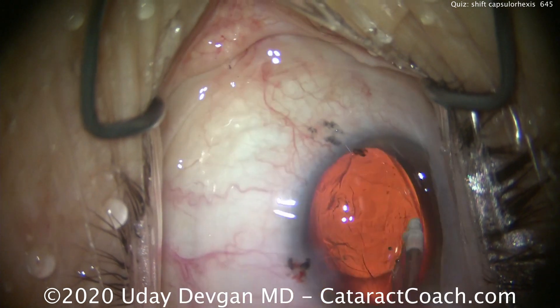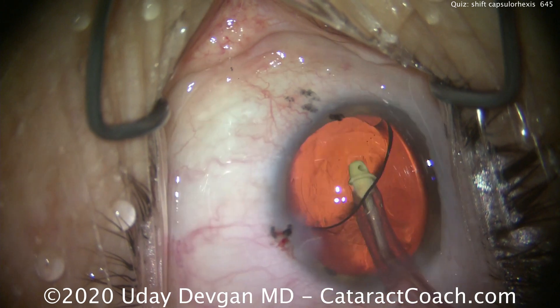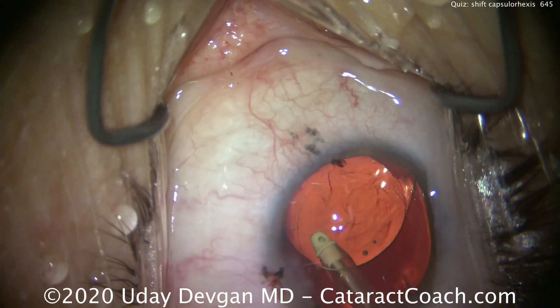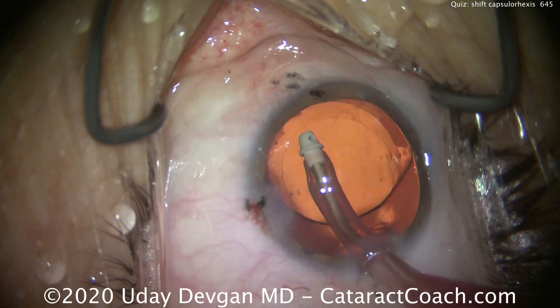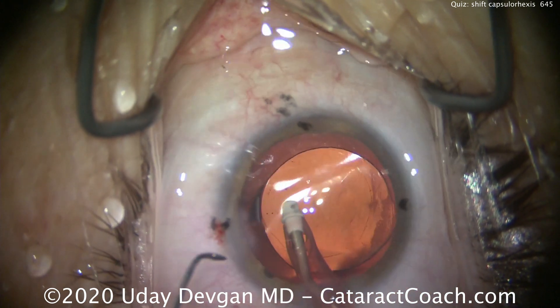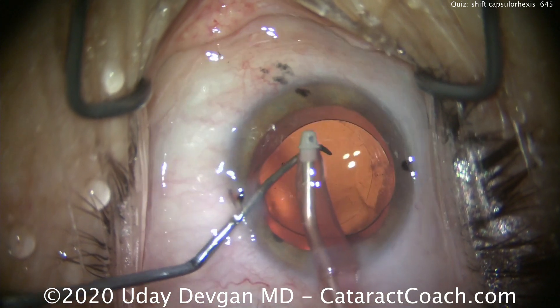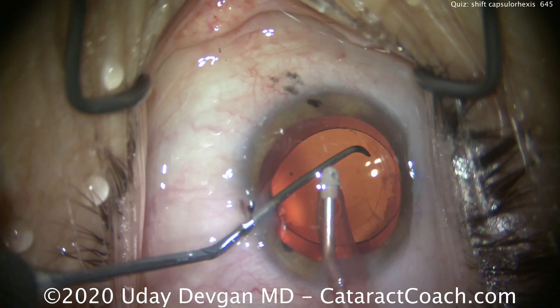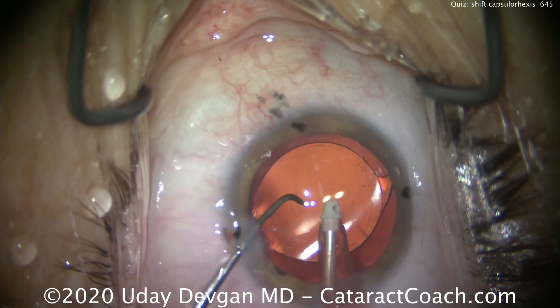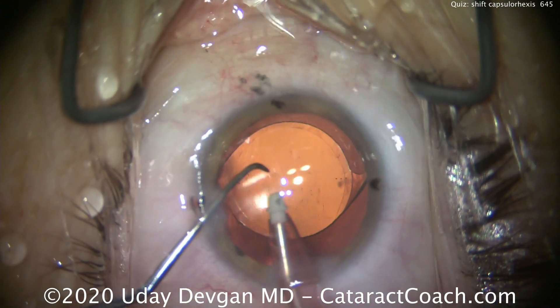We'll go in and remove the viscoelastic from the eye and finish up the case. To avoid parallax, we'll line up the Purkinje images, and then you'll see this capsular axis is in fact appropriately placed. You can also tell this patient's getting a toric lens — you see the three dots on either side at the haptic-optic junction. So we'll center up that lens and make sure we have it where we want it.